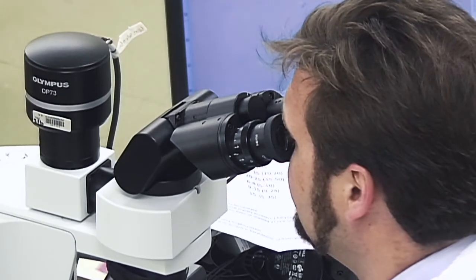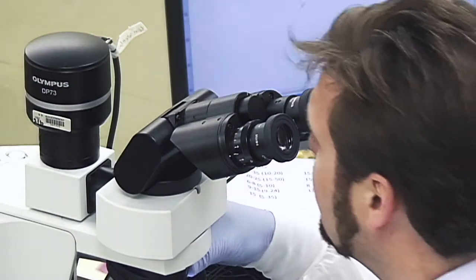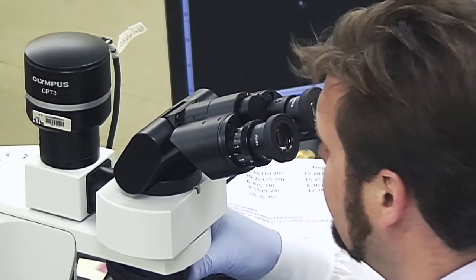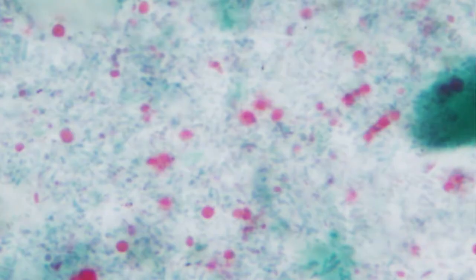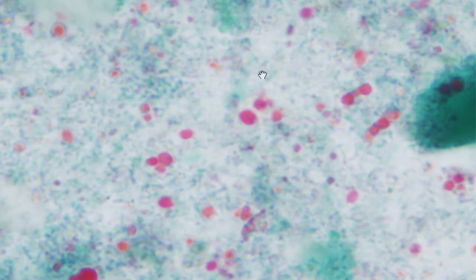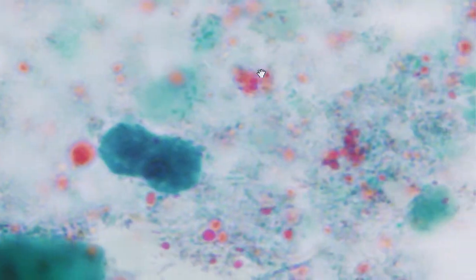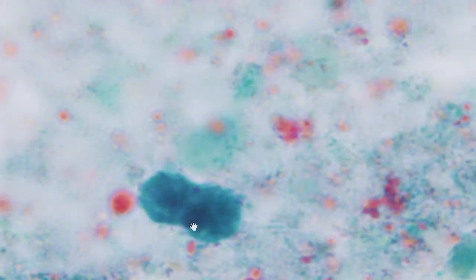So here I have a slide which is full of lovely trophozoites of Entamoeba histolytica. I'm just going to zoom in and get it into focus. And here we go. So that's nice, and let's move it back down to standard size focus for you and correct for the white background. And away we go. So here is a very, very nice trophozoite. Just really in nice shape.